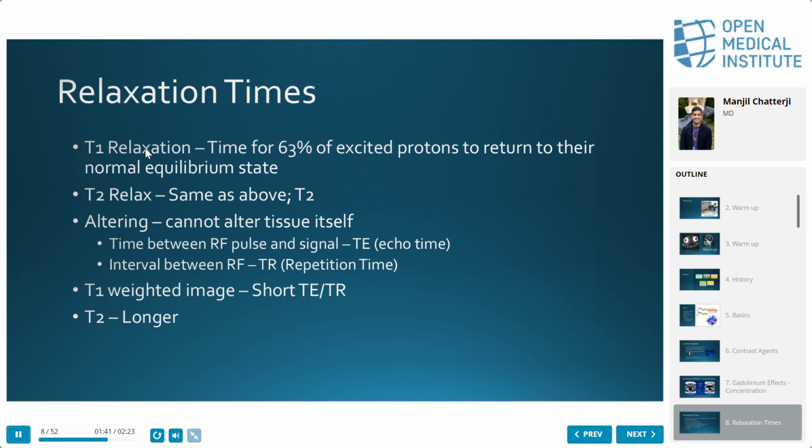And then you can use some different maneuvers here to determine the relaxation times of different substances. And the easiest way to do that is an RF pulse. So if you put the patient in the magnet, well, the problem with that is all the protons are then facing one direction. There's no signal there either, is there? The signal from that will be 100%, right? Because all of the protons are in the same direction. You can't tell the difference between water and fat because that magnet is so strong that there's no differential there. Does that make sense to everyone? Magnet is too strong.